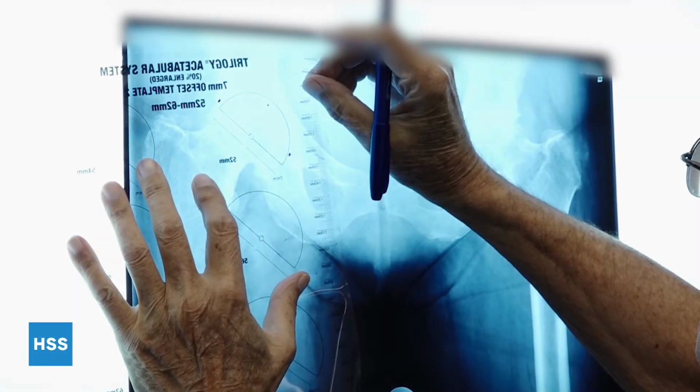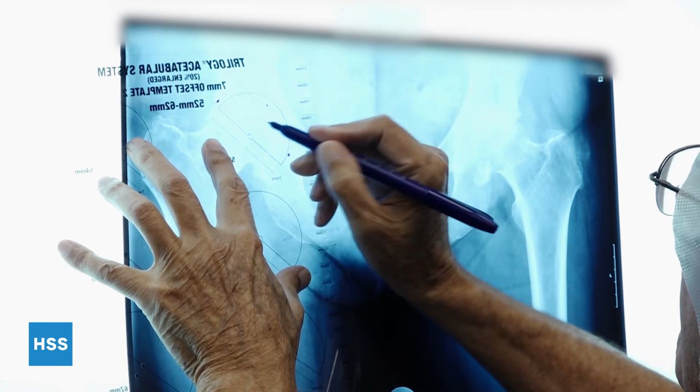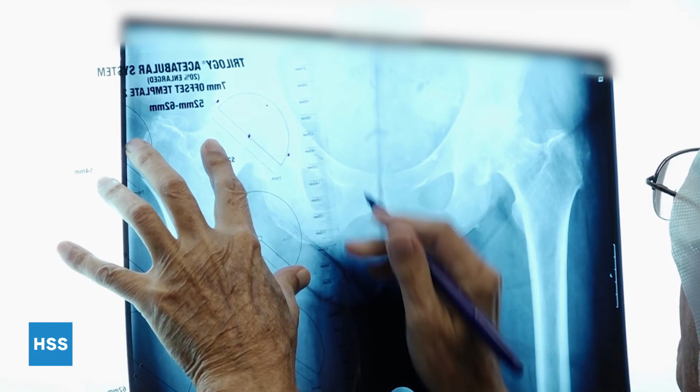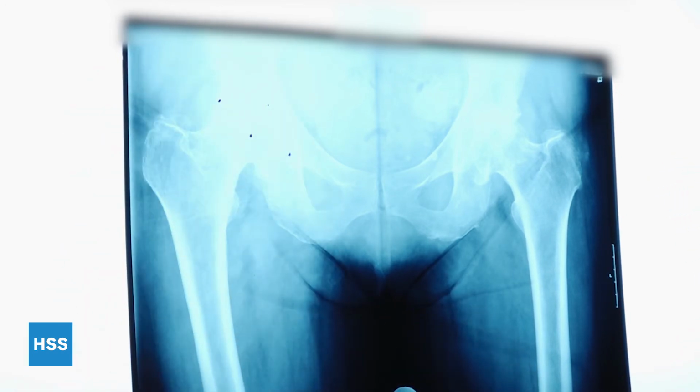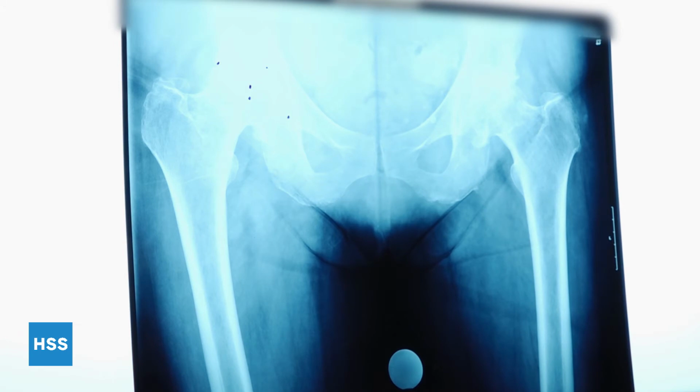I prefer to use acetate templates to define the size of the cup and its center of rotation. The preoperative templating starts with the acetabular cup, placing a dot on the lateral wall of the teardrop, another on the superolateral margin of the acetabulum, and a third one on the superomedial dome. The size of the cup is recorded on an adhesive tape placed beside the X-ray. We then proceed to define the new center of the prosthetic head, compensating for any leg length discrepancy based on the clinical and X-ray findings.